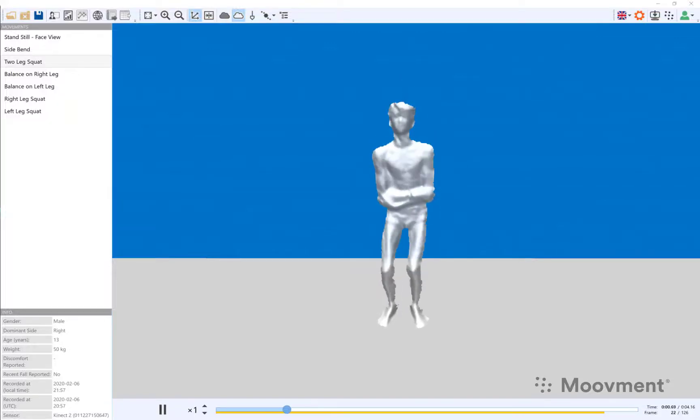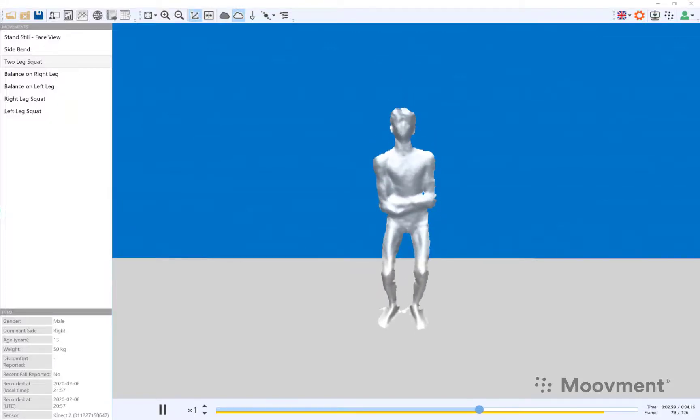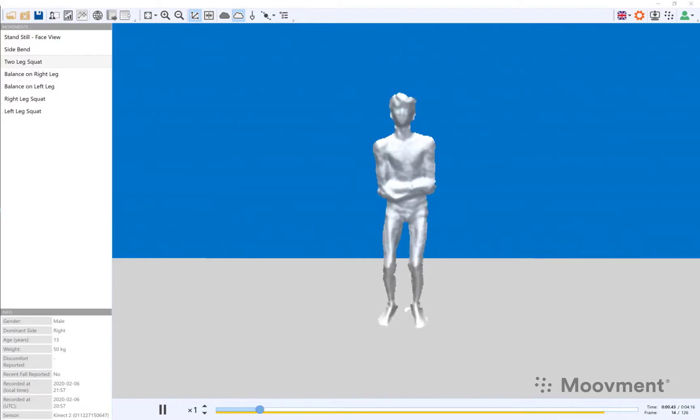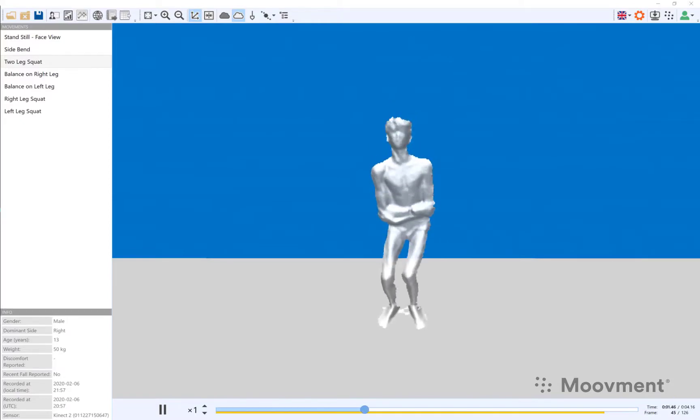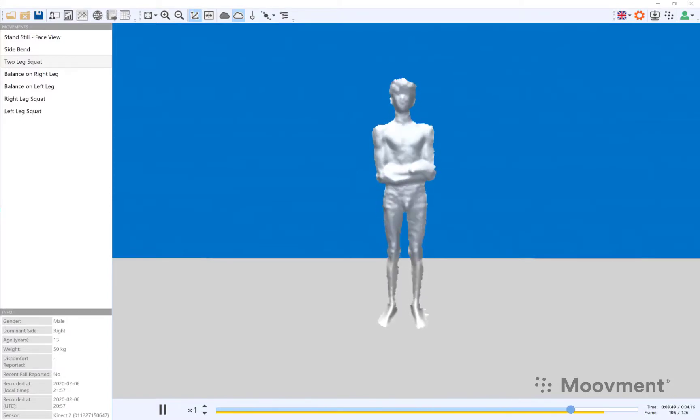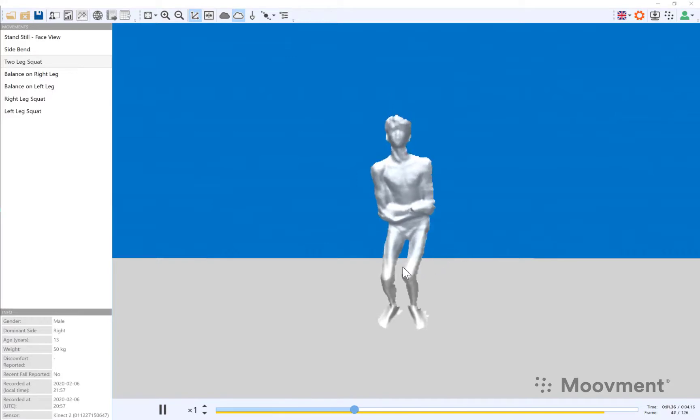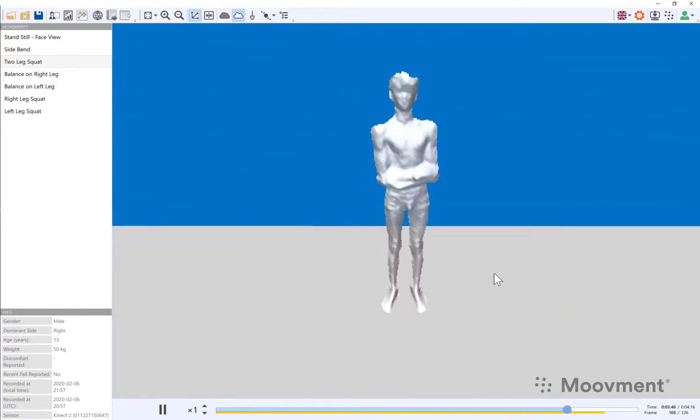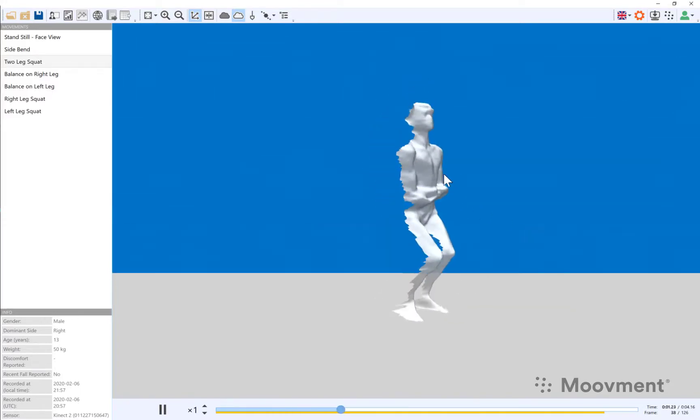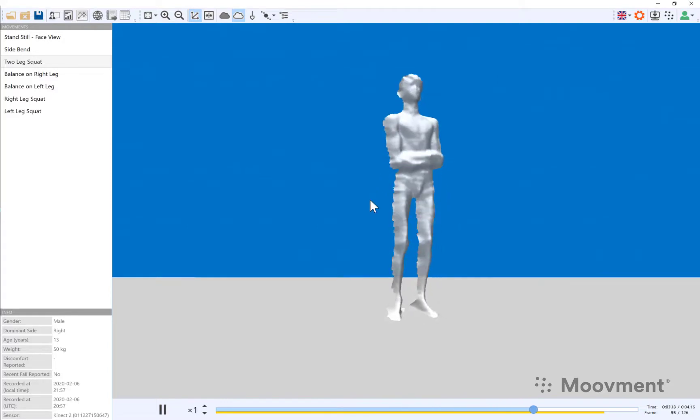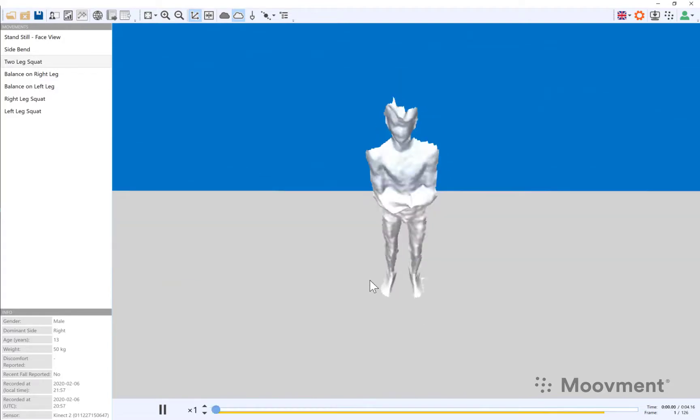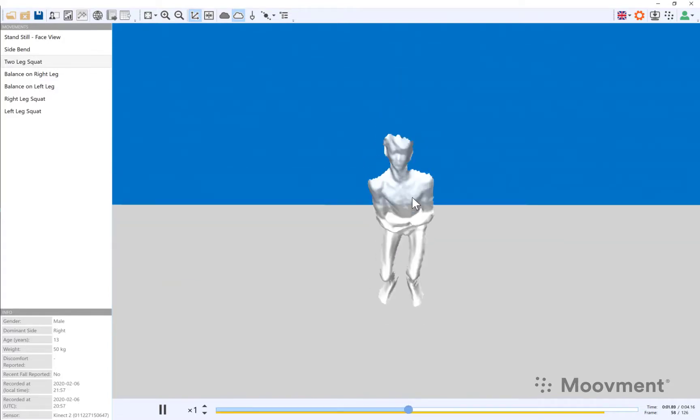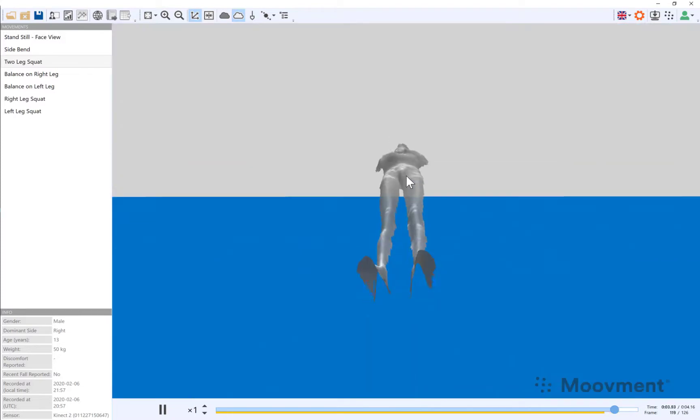I'd like to take you on a tour of the Movement Lab and Movement Pro software. Here we have an individual doing a double leg squat, and as you can see we're recording in 3D so you can see images from the front, from the side, from the top, and from below.